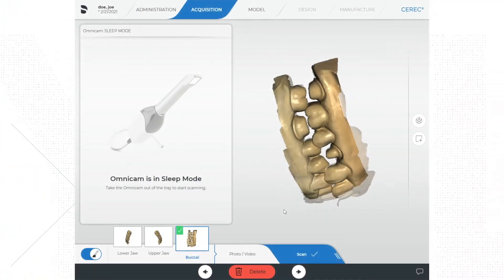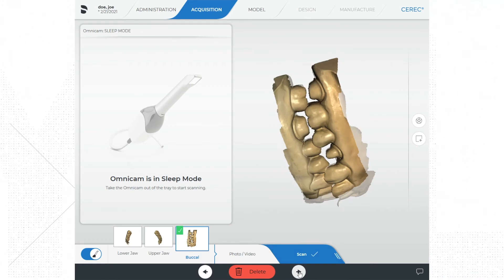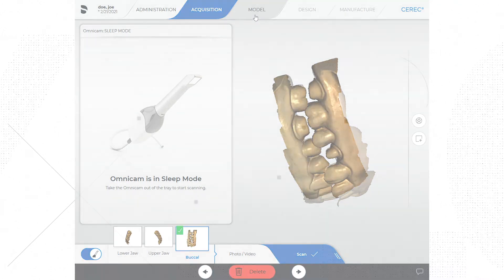I would recommend you save a couple of times through the fabrication process. I personally like to save after every phase in the phase bar. At a minimum I would save once after scanning and once after you design — maybe even save after you work on your models if you had to spend a lot of time tracing the margin or trimming the models. After we save, you can either hit the arrow button at the bottom of the screen or click on model in the phase menu.